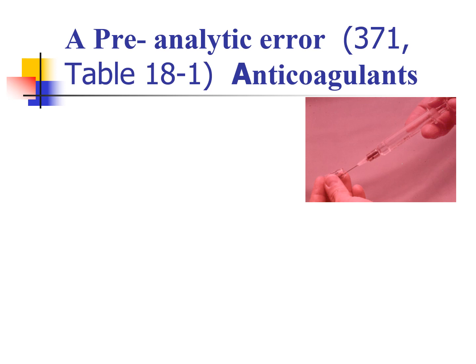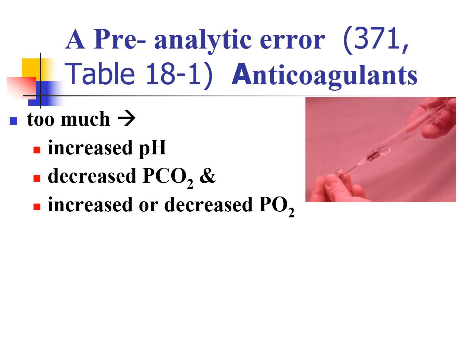All right, so we've covered sites, so let's look at things that go on with the blood gas itself. Just as far as the equipment and troubleshooting, there's things like too much anticoagulant or too much heparin in the syringe. There's heparin in the syringe so the blood doesn't clot up after we draw it, so we can take it to the lab and run the gas. If there's too much, it will actually increase the pH, so the pH will get more alkalotic, or more basic, right?